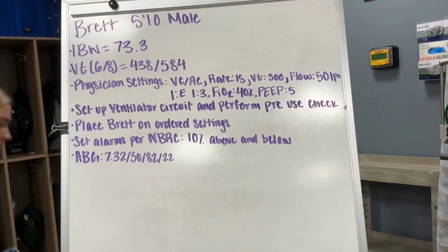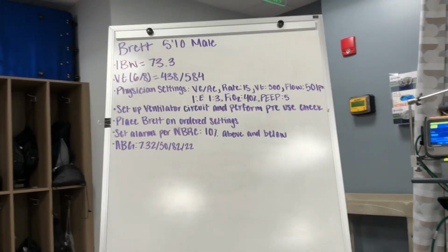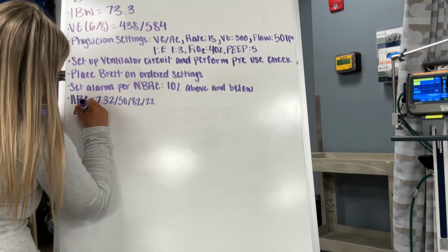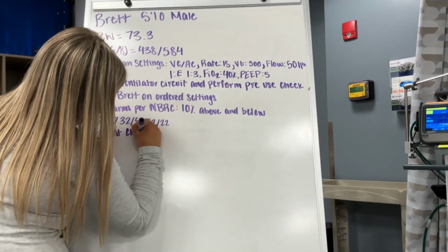There's a specific one, because if it's above 49, you have to increase one of them, but I can't remember. I'm gonna guess respiratory rate. Respiratory rate's correct. So we're going to change the respiratory rate. You want it to go higher, right? So make the change on the vents.